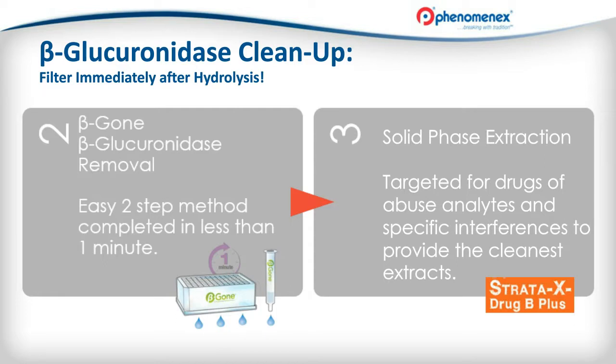So this product serves as a collection plate and then simply as a filtration device to remove the beta-glucuronidase, whereas with the SPE, we would filter, wash, and elute. So a few more steps with SPE, a little bit cleaner, but again, 2 options for products that contain SPE media that can also be used as a collection plate. Okay, there you go, in-well hydrolysis solutions.